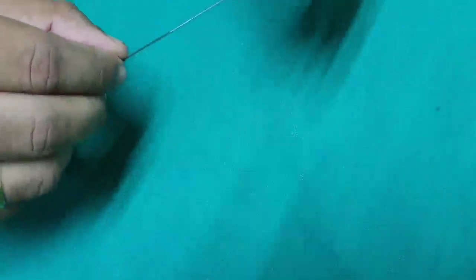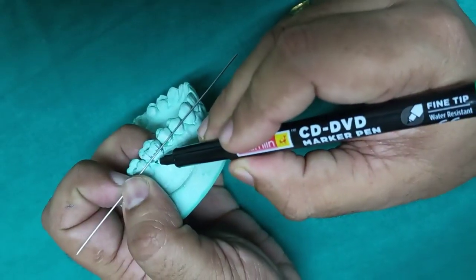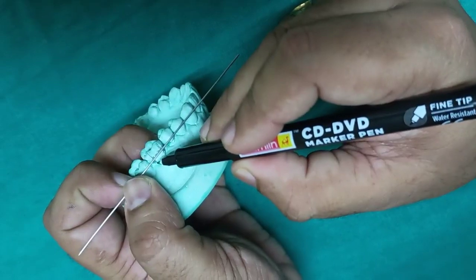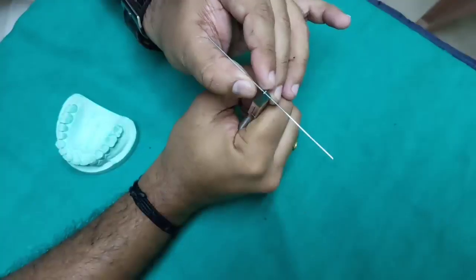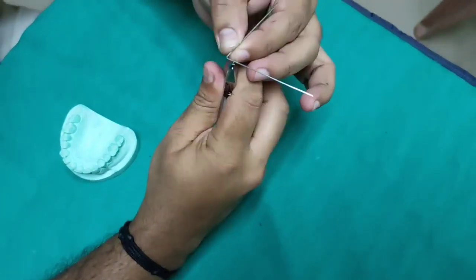Take an adequate length of 0.7 mm stainless steel wire and transfer the length of the bridge as marked in the cast to the wire in the center portion. After marking, we are going for arrowhead fabrication.